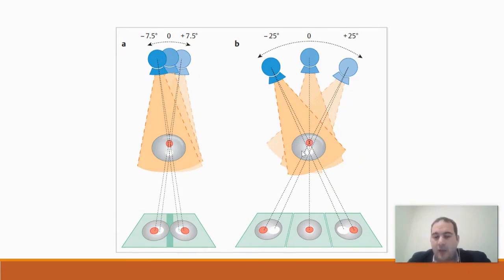You can see here that there are two lesions, and these two are superimposed on each other, meaning they are overlapped. In this case, you get a signal here on your image receptor, and you cannot differentiate between these two lesions that are present. When you take different angles, there are devices that can assist you. Okay, this is also a type of machine that exists. In summary, from the specific angles, you can observe the two entities and differentiate them by looking at them.